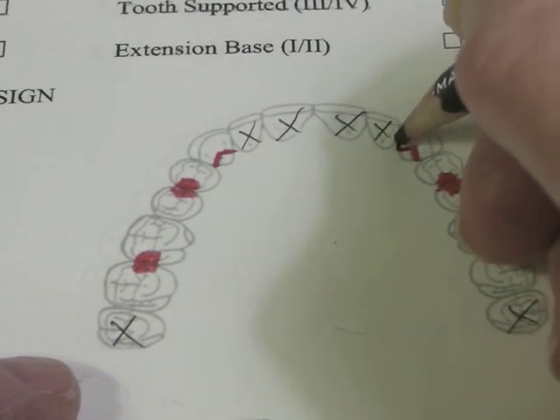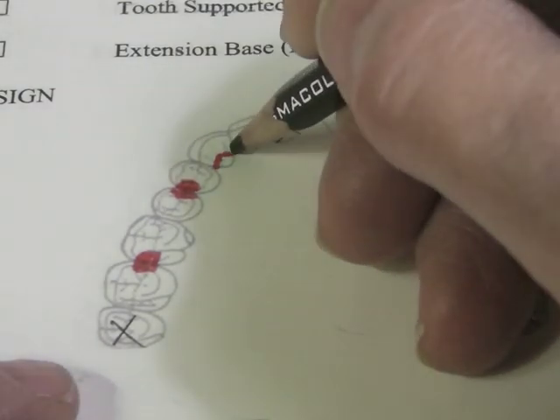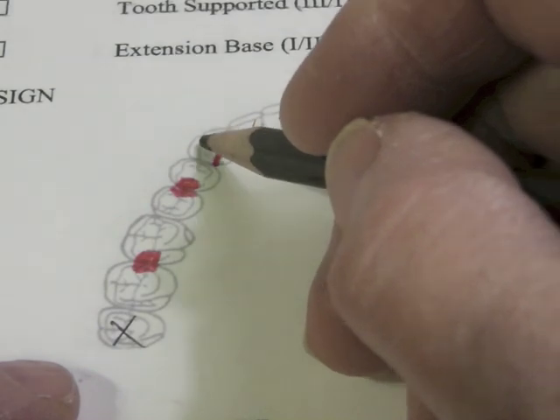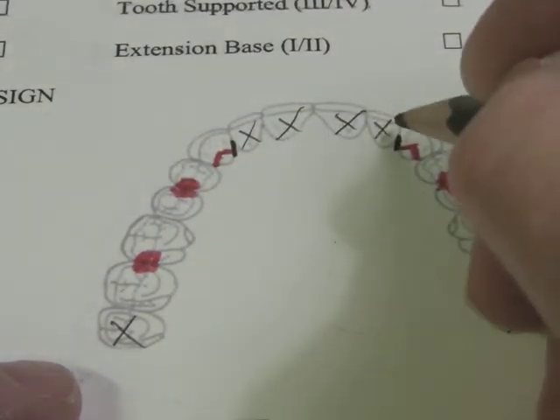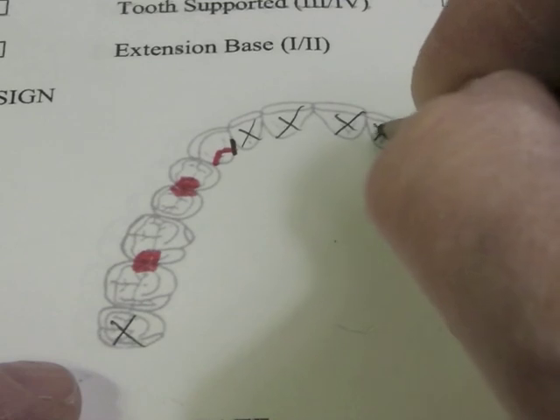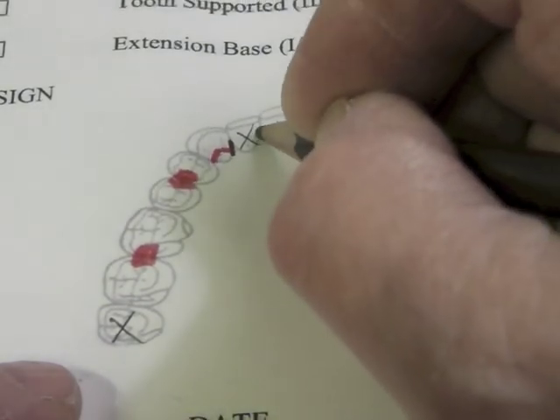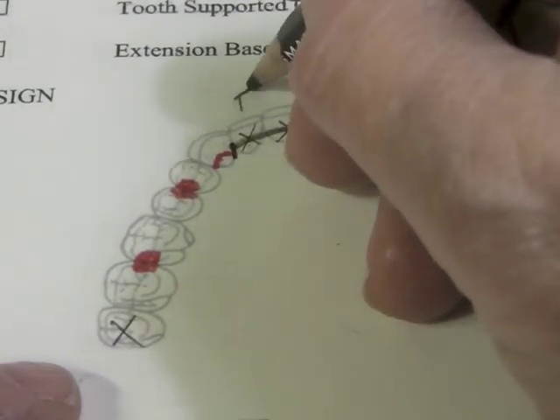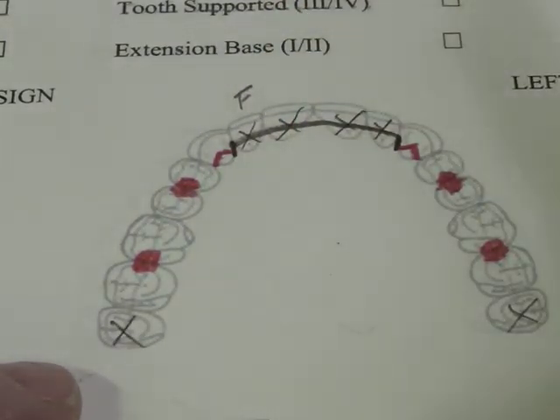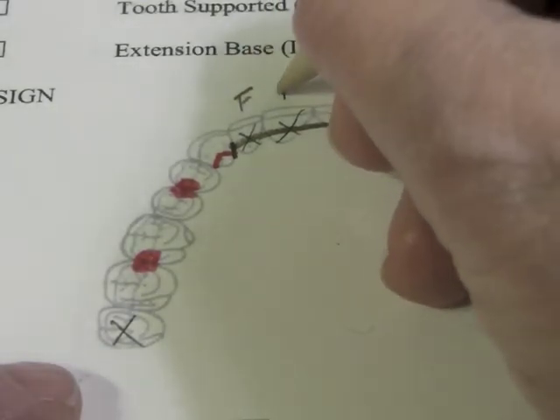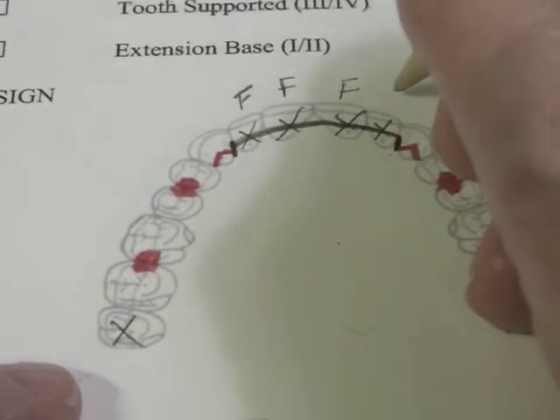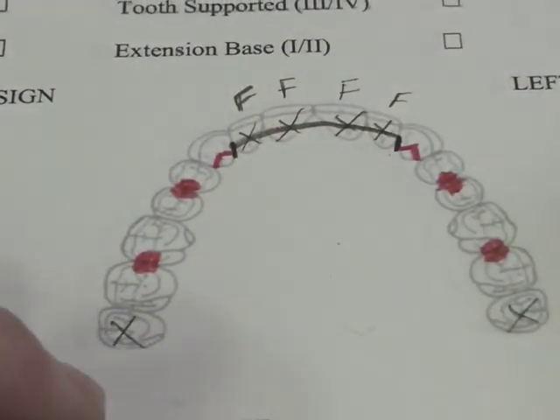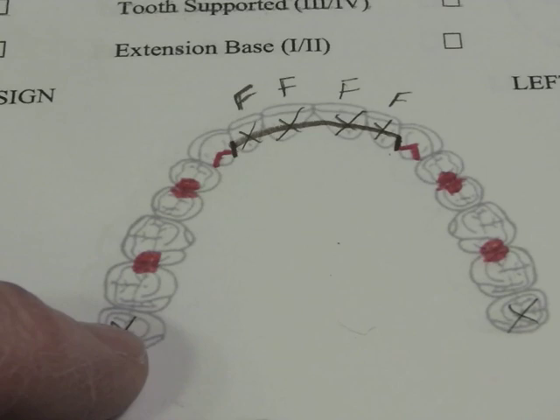we will have a guide plate on the mesial surface of the canines just behind the cusp tip. And the facing is drawn with a straight line across from guide plate to guide plate. And then we have four F's out on the cast. Our textbook says to use lead pencils on the cast to show that we're having facings.